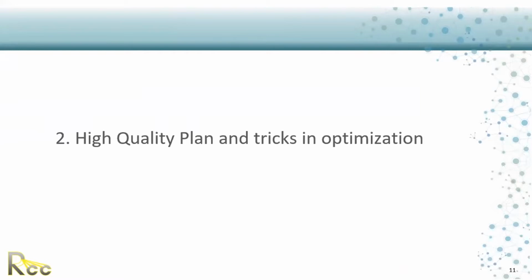Okay, excellent. This is a very good question. You know that the mask itself is not 100% matching, or let's say there are no zero gaps between the mask itself and the body. There are some gaps, and these gaps are the issue. It's not the mask itself. The mask is tissue equivalent, which is fine. This is what we are using. But the problem is that there are gaps between the mask itself and the patient surface. These gaps are making trouble for us, especially in dose calculation nearby the surface.